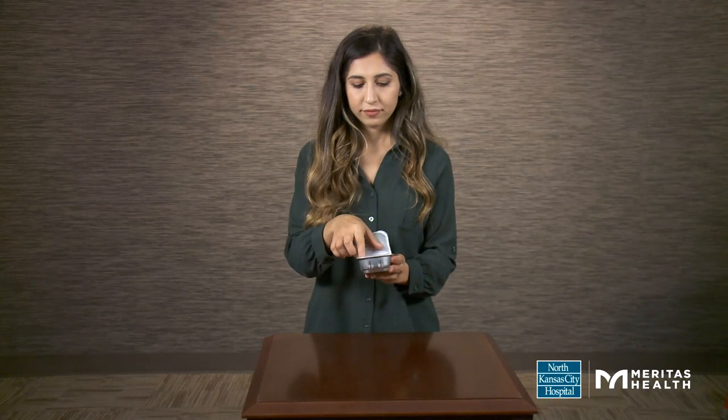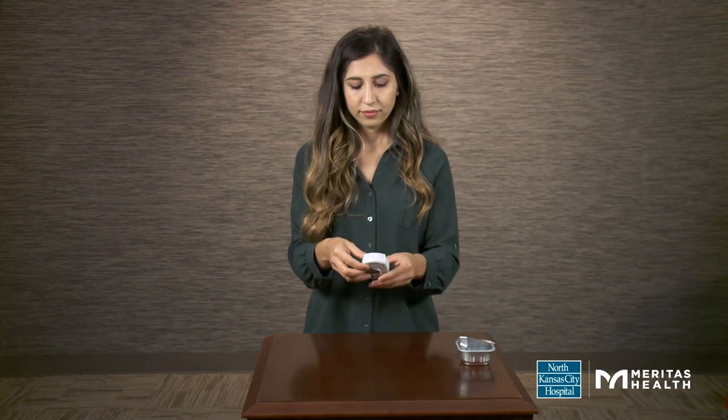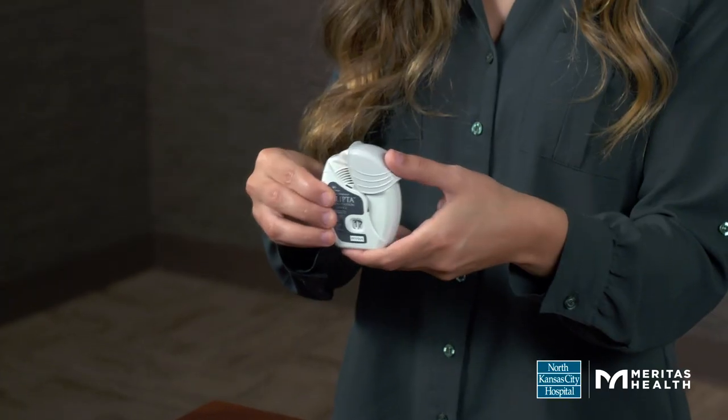Take the Ellipta inhaler out of the tray. Open the cover of the inhaler until you hear a click.